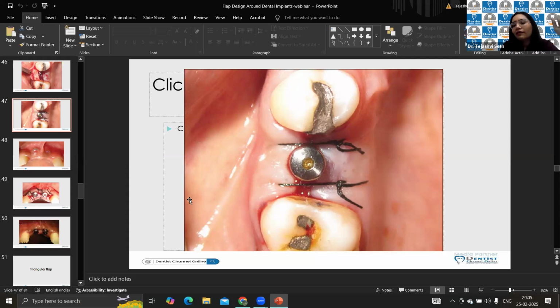You have to constantly check whether it is getting adapted or not. If not, then place the blade parallel and give a very superficial incision, dissecting your fibers. Just release it. Or even if you're not comfortable and you're scared that you might sever any blood vessels, then just take a blunt periosteal elevator and try to release it.